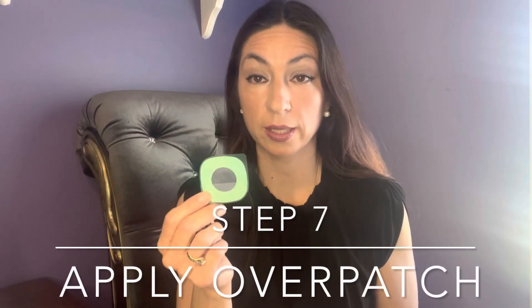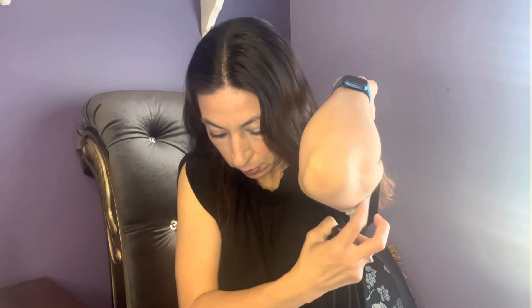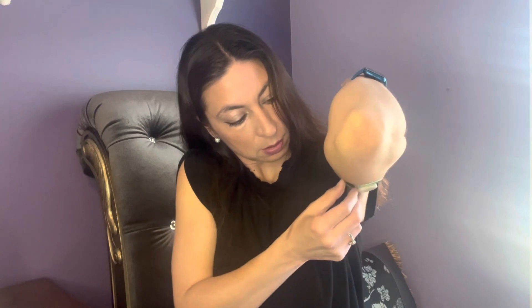The last step is to apply the overpatch, which will help keep the device attached to you for the duration of the 10 days. Remove both clear liners on one side without touching the white adhesive area. Then hold it by the green part to apply it around your device. Once it's around the device, take the green part off and rub around it to make sure it stays on. And that's it — that's the whole thing. Didn't even hurt at all.